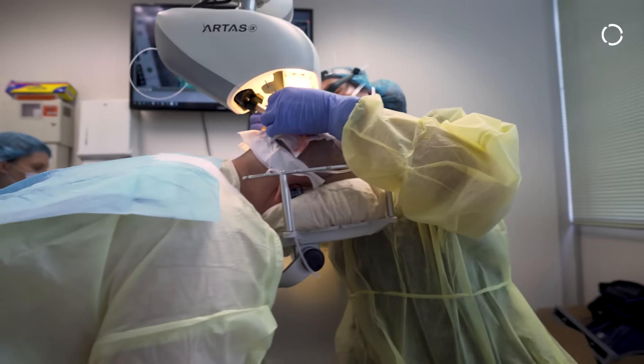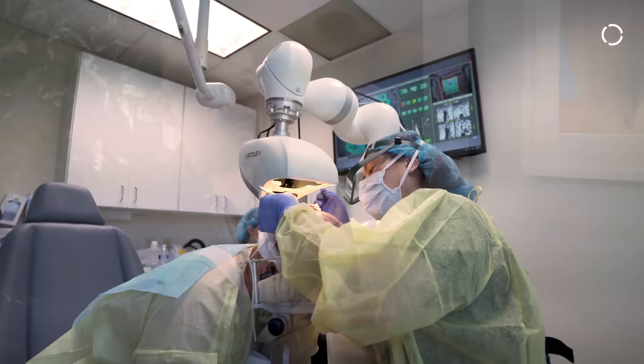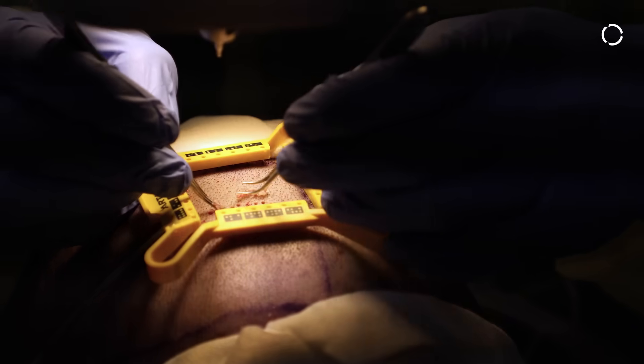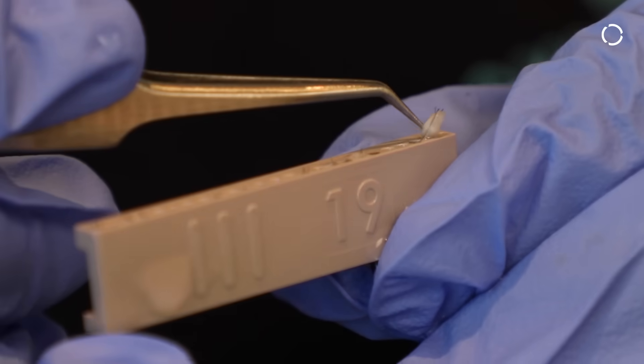Hair restoration is a very particular aesthetic procedure. You're basically transplanting an organ which is the grafts, but you're doing it a thousand times, two thousand times. A graft is really tiny, it's only a few millimeters in length and it's a very delicate structure.